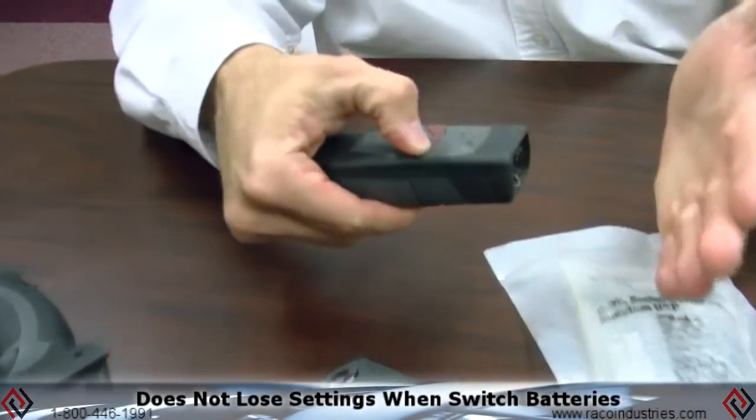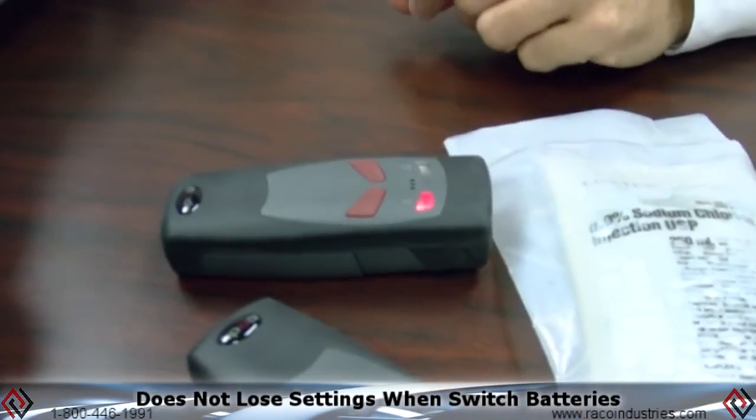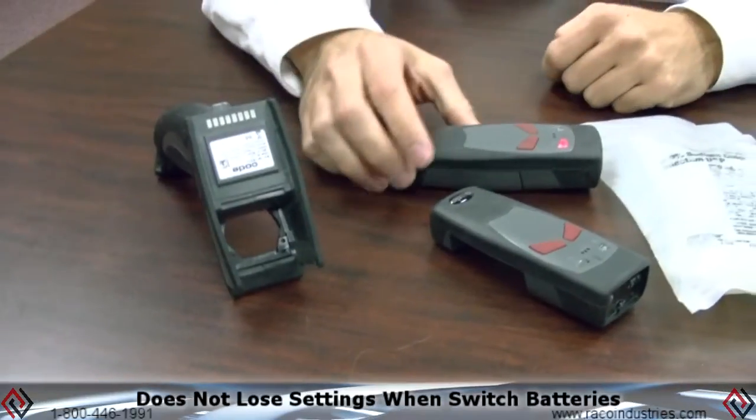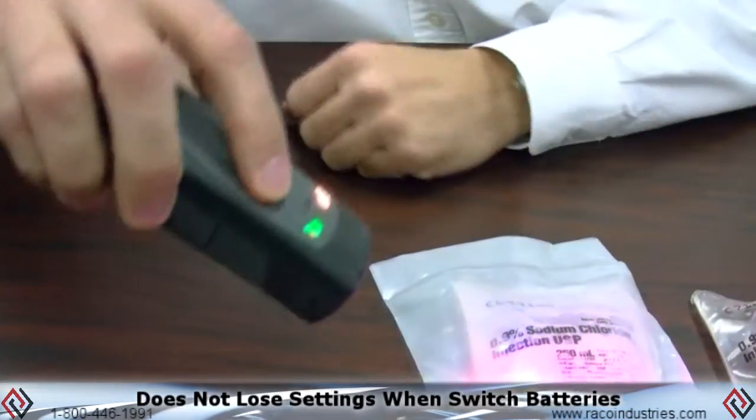Switching between formats doesn't lose any of the scanner's settings — it simply turns on ready to go. You're just changing it to whatever is most comfortable for you. The reader does not go out of commission if the battery goes dead; you simply put a new one in, continue scanning, connect up, and go on your way.